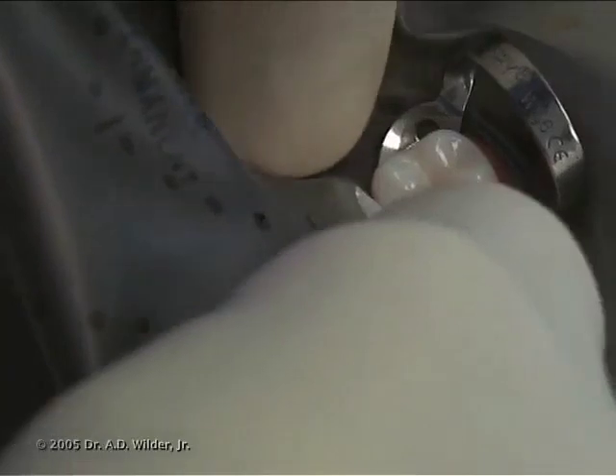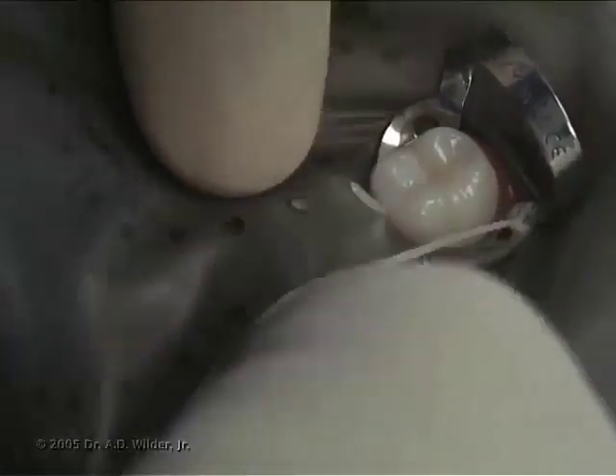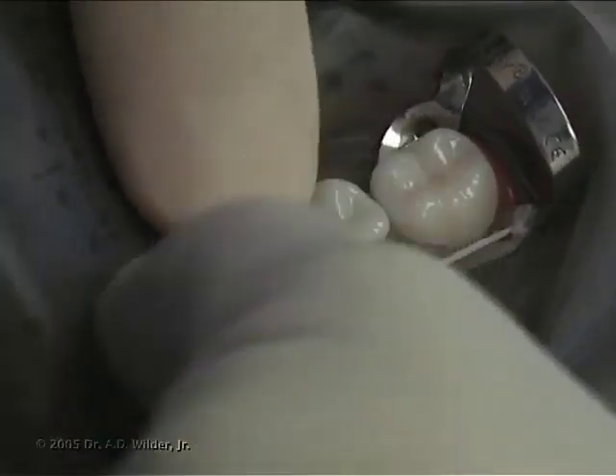Gently work the rubber dam around and underneath the clamp as well as around each tooth with your fingers. A water-soluble lubricant or simply saliva can help the segments of the rubber dam work in between adjacent teeth a bit easier.